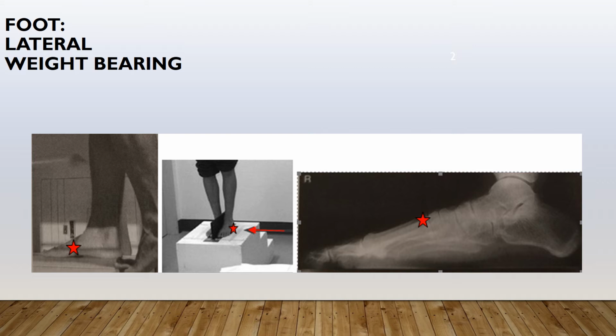Image evaluation. If you have steps that have a slot that will hold an image receptor, then go ahead and place the image receptor into the slot and have the patient straddle the image receptor. Place the medial side of the foot against the image receptor and allow the patient to bear weight. The entire foot with 1 inch of distal tibia and fibula should be within the collimated field. The dorsum to plantar surface is demonstrated, and the heads of the metatarsals are superimposed. Soft tissue, cortical margins, and sharp bony trabeculation are clearly demonstrated.